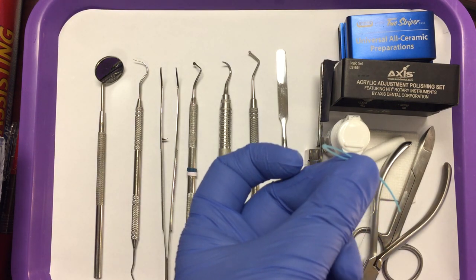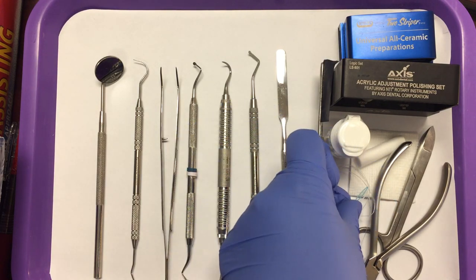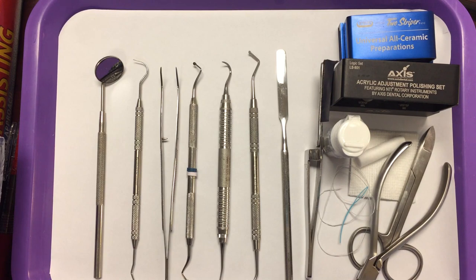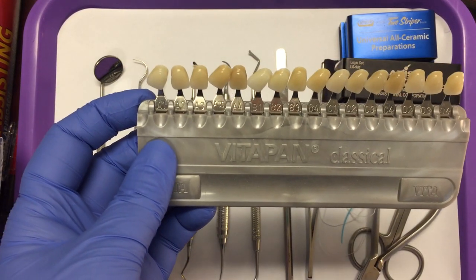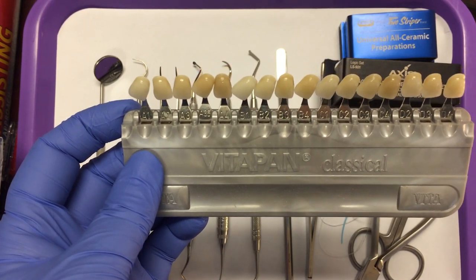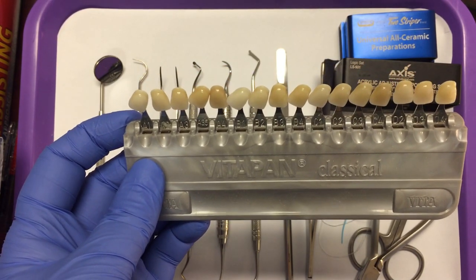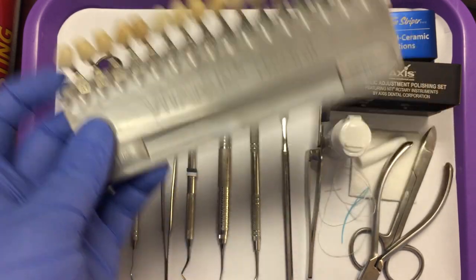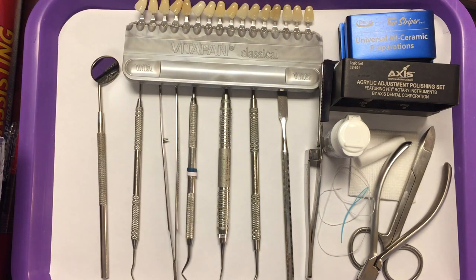If we were making the patient a bridge, we would also need the floss threader. The last item you would put on your tray setup is your shade guide. Remember, you need to take the shade in natural light before the tooth has been worked on to get an accurate shade match. And that will be your crown and bridge preparation tray setup.